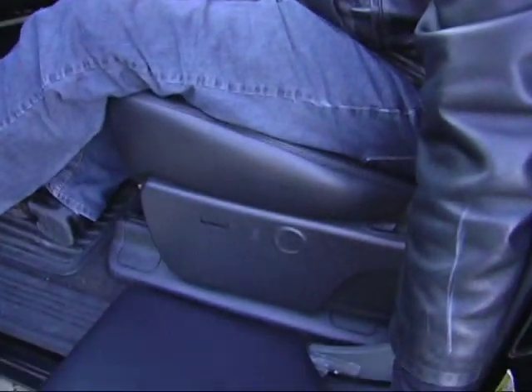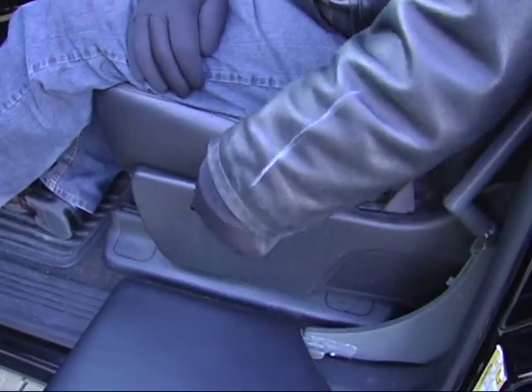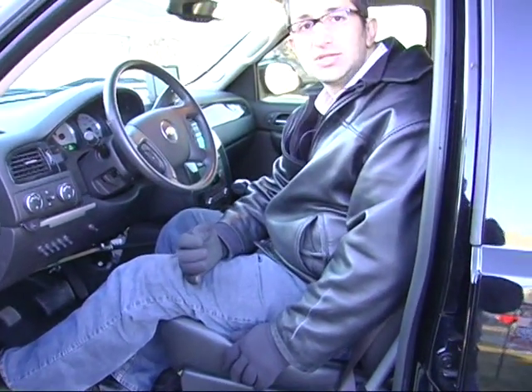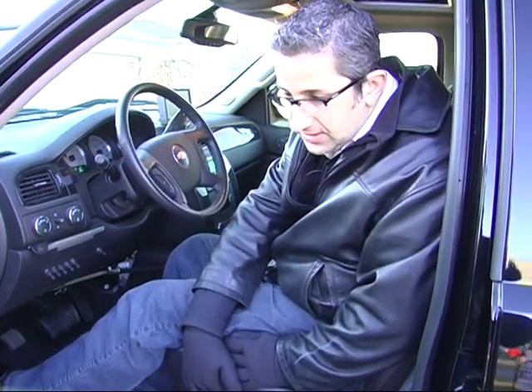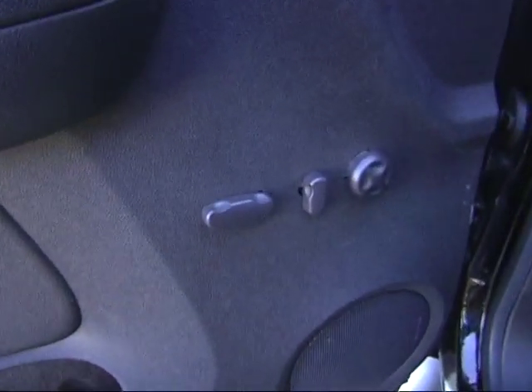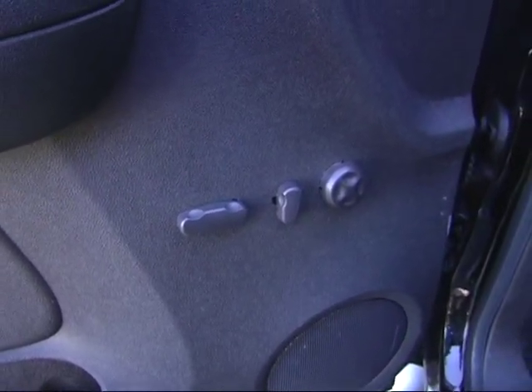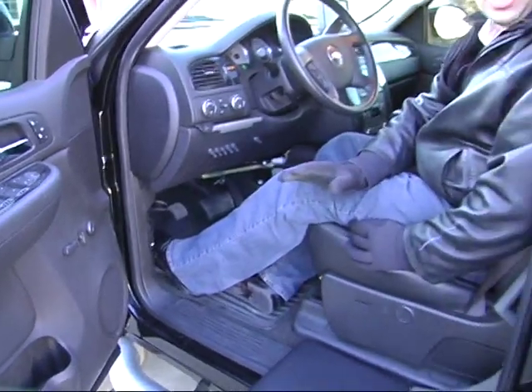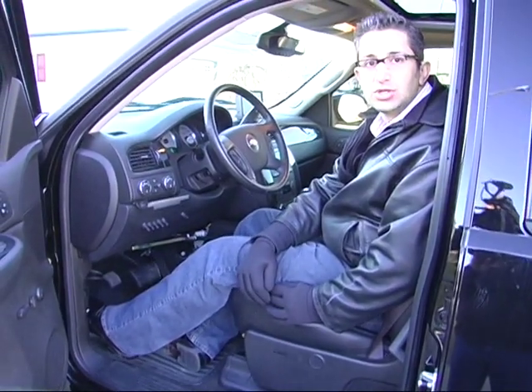So one thing that had to be changed in the vehicle was for the seat to be able to fold up and sit up against the vehicle, the chair when the door is shut. We had to move the controls for the seat, and one thing that paras or quads always want in a vehicle are power seats, so you don't have to keep pulling and pushing. So the electric seats are nice, but we ended up moving these so they wouldn't impede the seat to the door. In this vehicle it's a 6-way seat, and I didn't want to lose the heated seating component, whereas if I would have kept those there, we would have had to lose all the power seat and all the heated seats. So that was a modification that we just moved over into the door, and it seems to work just fine.